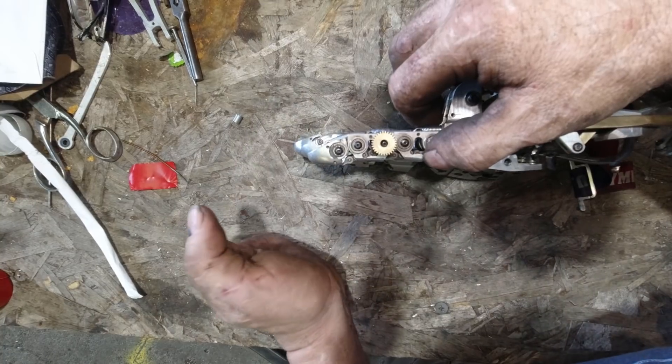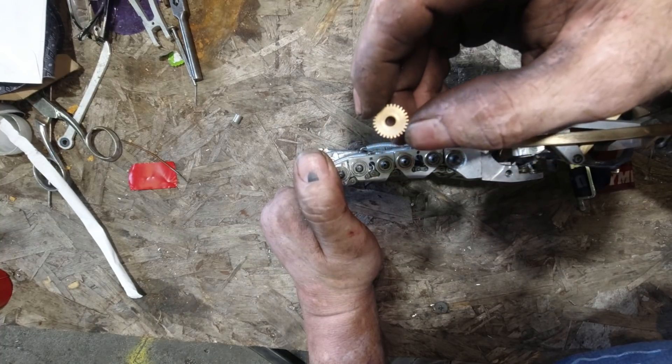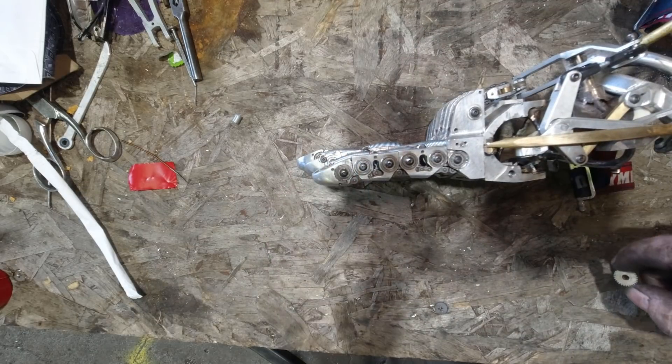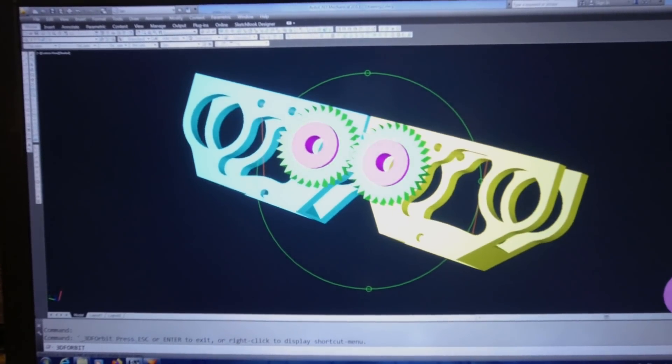I tried out a bunch of different springs to change the tension, but no matter what I did, the pinky, due to the shorter geometry, wouldn't close at the same rate to the same position as the other fingers. The fix that I came up with involves using a pair of brass gears for every joint of the finger.